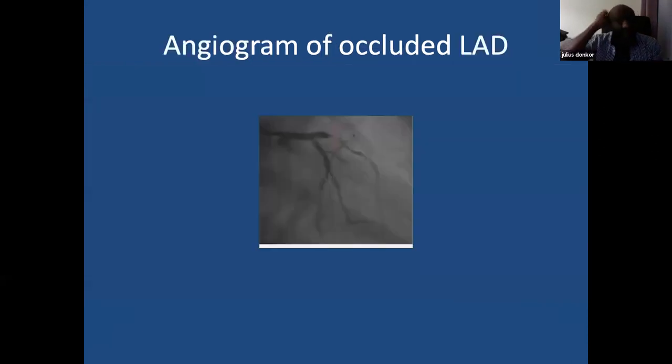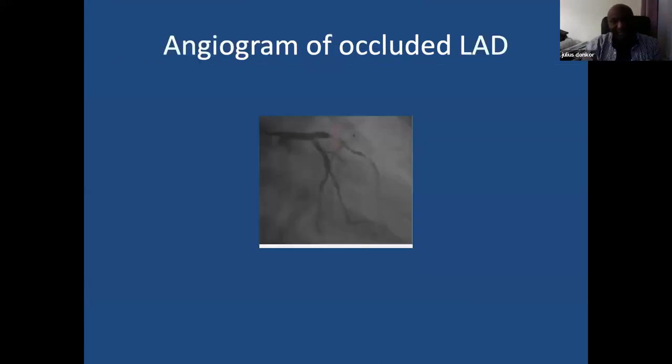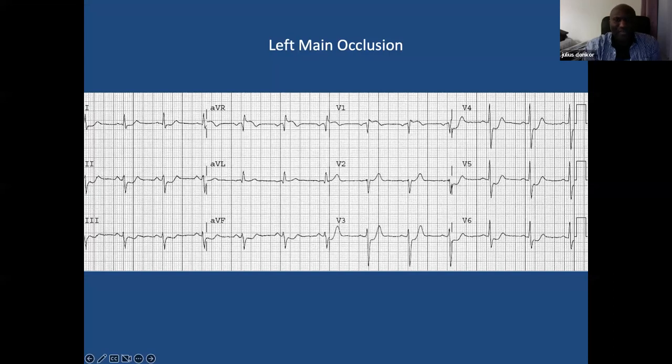So we went through an angiogram of an occlusion. Anterior MI, we learned last week, is usually your proximal LAD. It could be your mid LAD as well. Anterolateral involves your LAD and your circumflex usually. I think Dr. Duffy sent me an ECG during the week that had an anterolateral occlusion on it. So that's an angiogram. You can clearly see proximal LAD there. It's not completely blocked. There's some reperfusion there, but you can see right in the proximal area that it probably was once occluded.